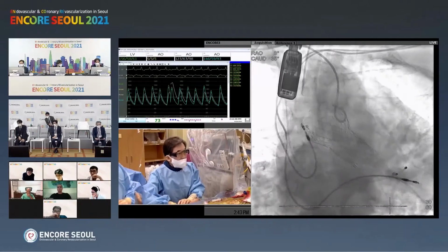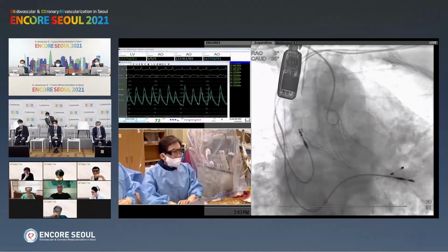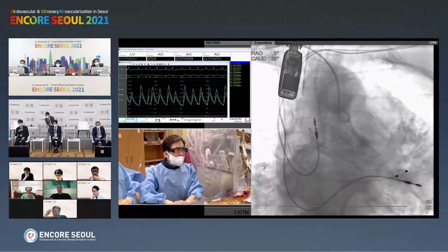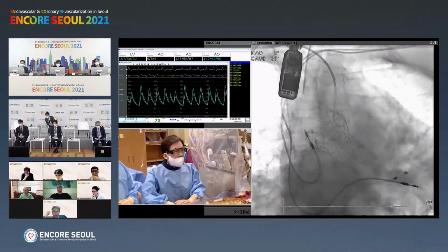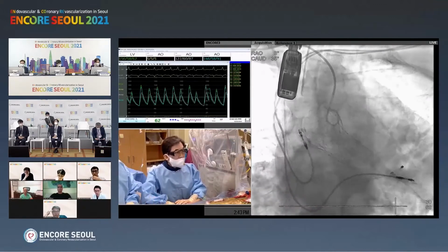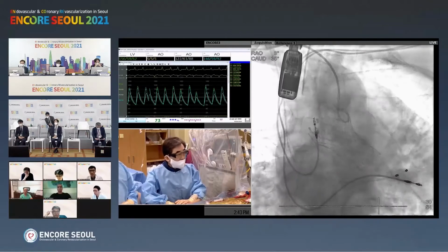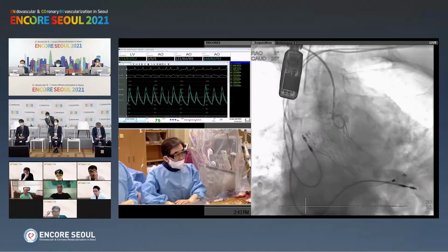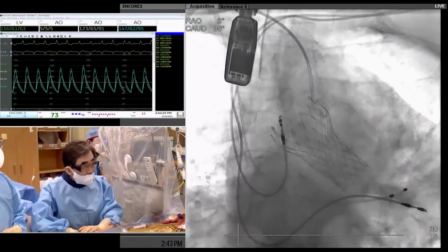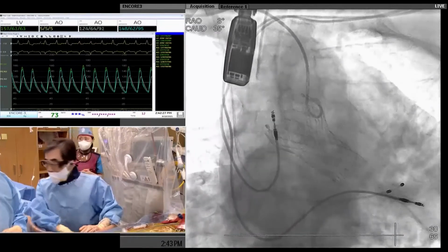I try to maintain the coronary height after TAVI valve implantation. When you implant the TAVI valve a little bit higher, the neo coronary height should be about 1 or 2 millimeters. Thus, it is very difficult to engage the coronary artery in the future. Thus, I try to maintain the depth of implantation. I think the depth would be 6 millimeter or how about 7 millimeter?